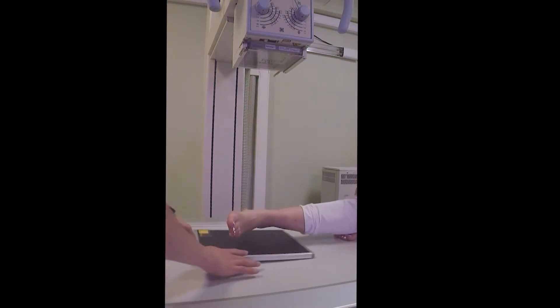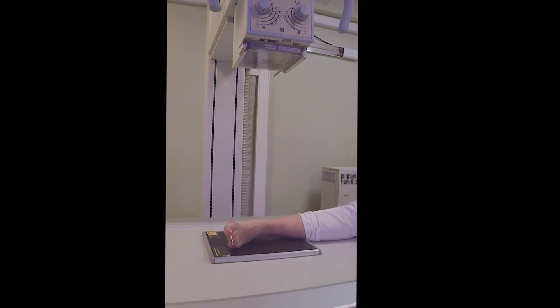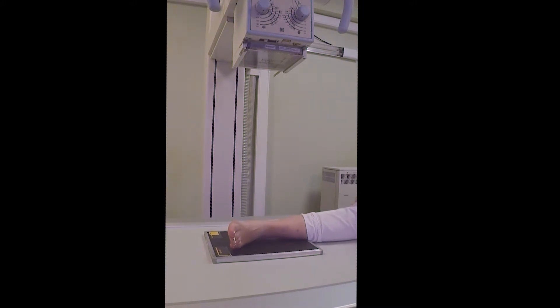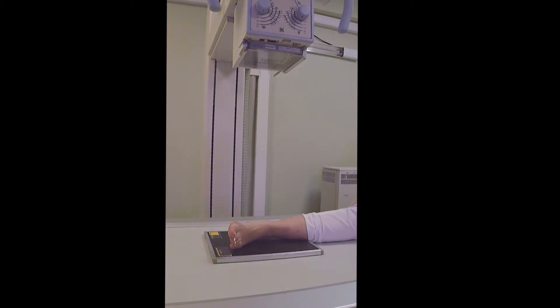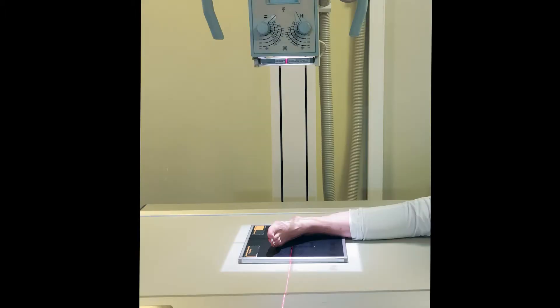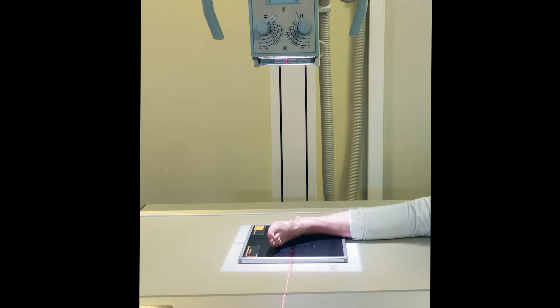Let's start with the classic lateral view, which is well known to every orthopedic surgeon from the beginning of his practice. To get this view, a patient should be laid down in decubitus position on the injury side. The injured foot is laid on the horizontal surface of the radiographic cassette. The x-ray is directed perpendicular to the cassette surface and sagittal plane of the foot.